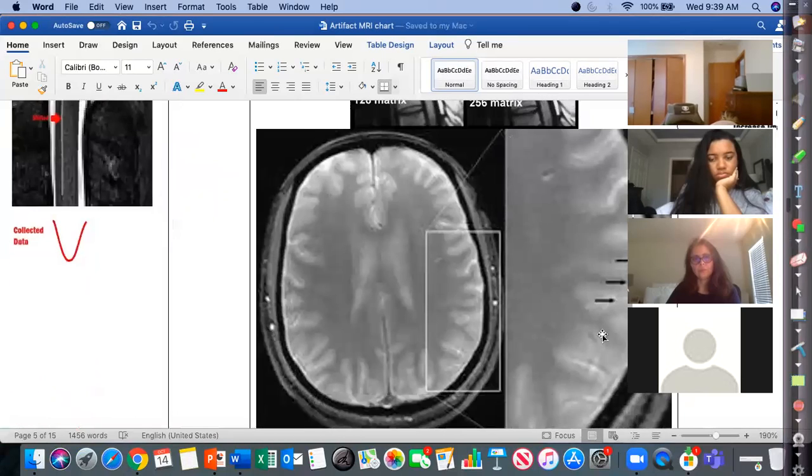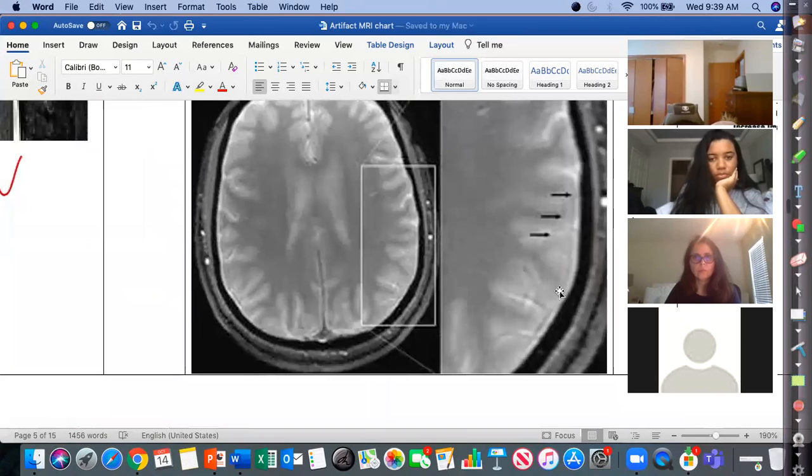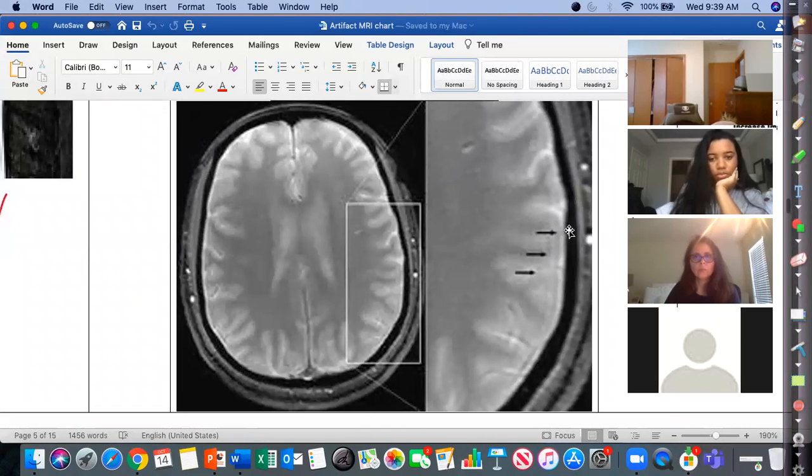Okay. And then we can also see it near the edges of the brain, where we get cortical bone, which is very dark, next to brain tissue or fluid that surrounds the brain tissue, which is very bright. Then you can see these streaking artifacts that look like when you hit water and it produces this waving effect.